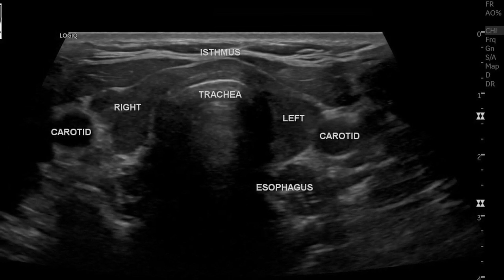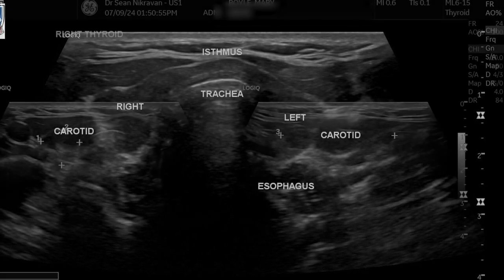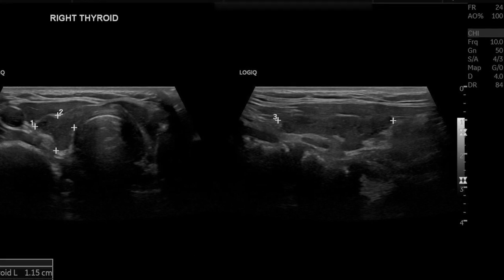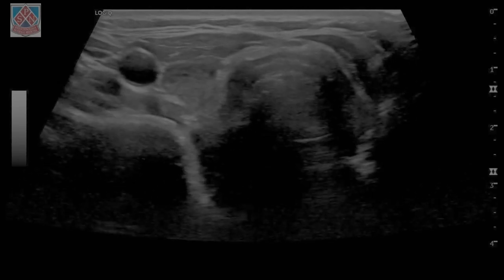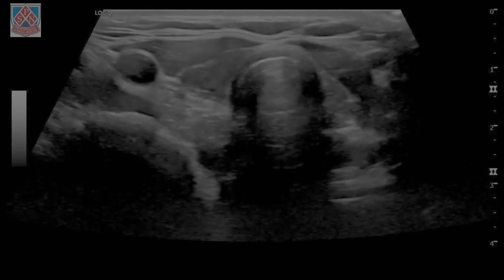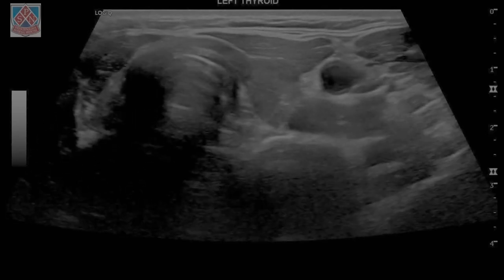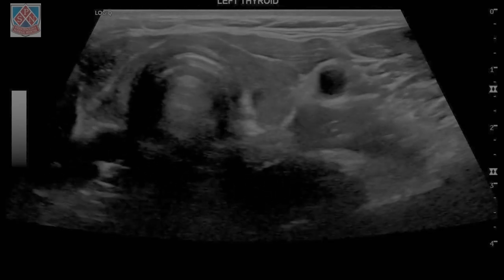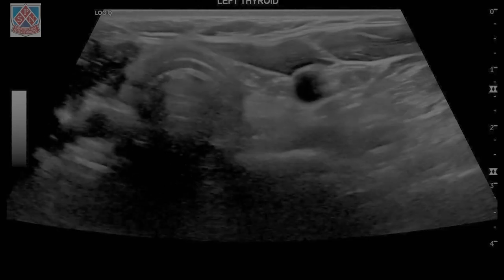If these patients are left untreated, the thyroid can become quite large based on dysfunction. Here you can truly see that there are very small characteristics of the tissue, and it's very small here. You can see the video, and you see that there are blotchy segments within the thyroid. There are some lighter, darker areas seen here on the same video on the left-hand side, very similar. You can see there are little blotchy areas, and there's loss of texture consistent with Hashimoto's thyroiditis.